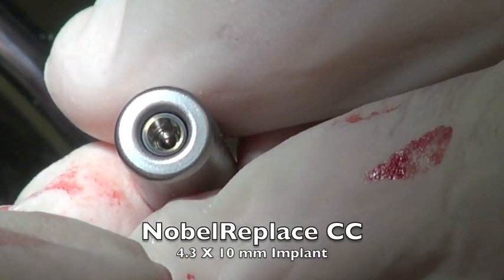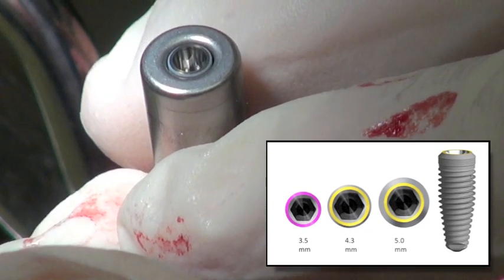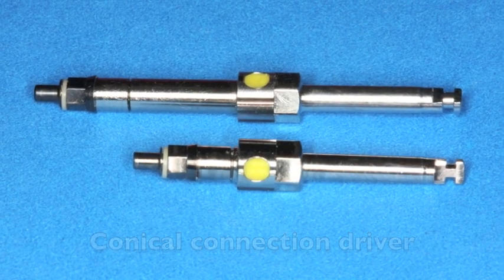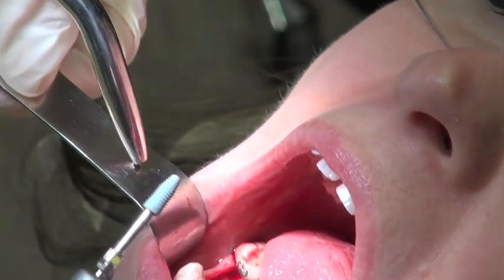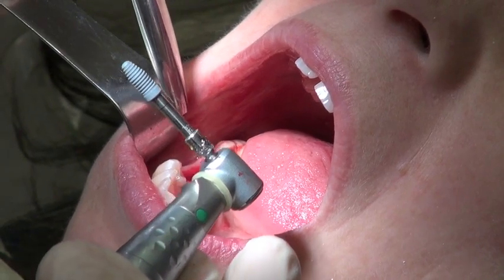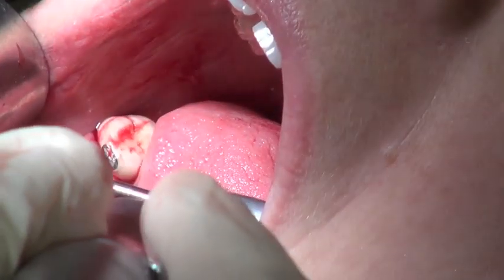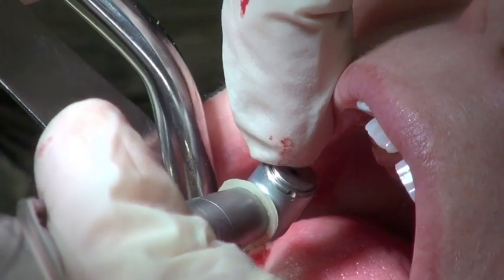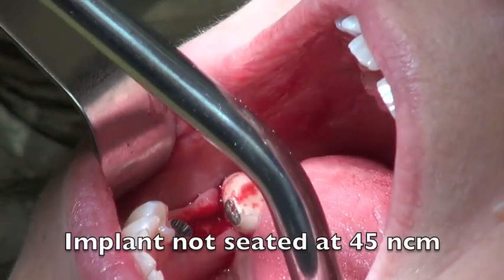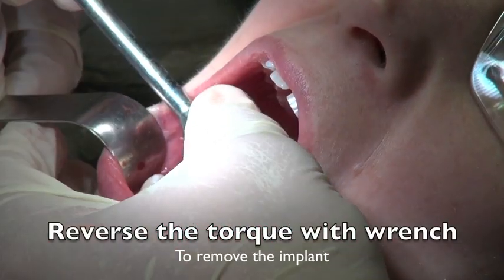The implant has a platform shift with a 45 degree angle on top, a conical connection, and an internal hex. We won't be using the internal hex on the bridge, but we can use it to carry the implant to the mouth using a conical connection driver, which grabs nicely because of the hex and conical connection. I use a long driver to easily get around the two adjacent teeth. During this procedure I keep the back of the drill head towards the lingual cusp to maintain screw retained position. The implant isn't seating at 45 newtons, so I'm going to take it out and prepare the osteotomy a little more.